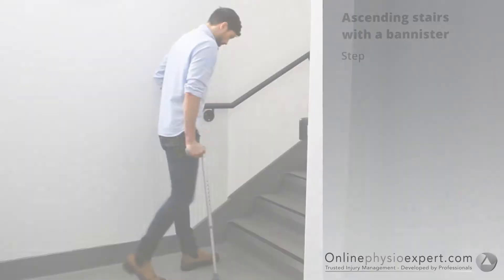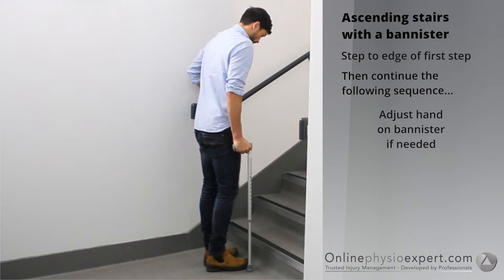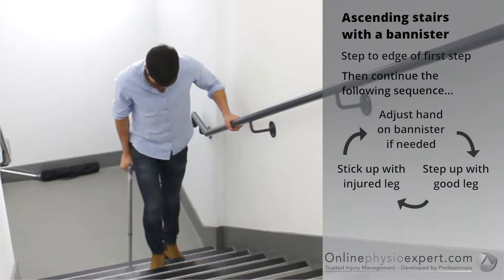To ascend stairs safely, step your feet to the edge of the first step. Place your hand forwards on the banister. Step your non-injured leg to the next step, followed by your injured leg with the stick. Repeat these sequence of movements until you safely reach the landing.